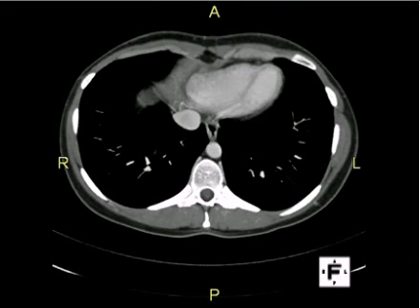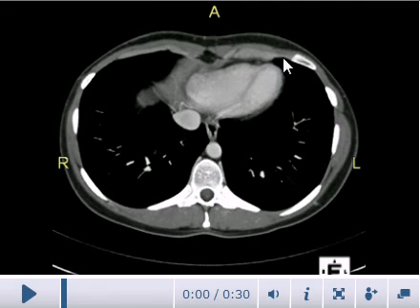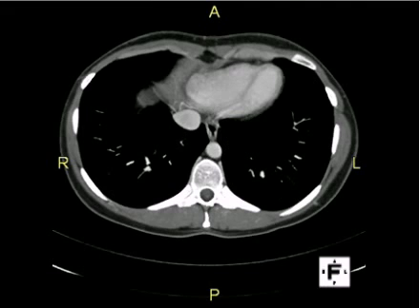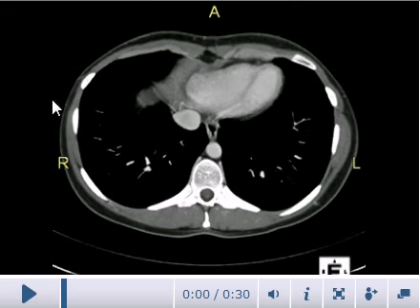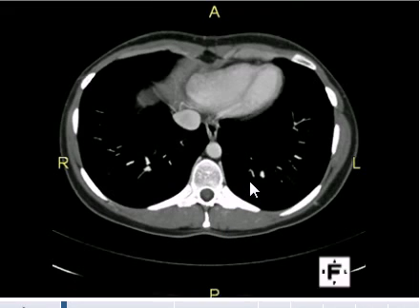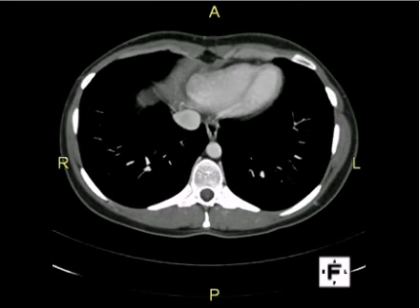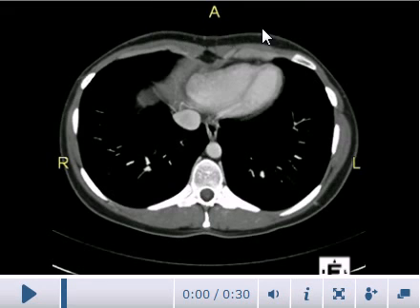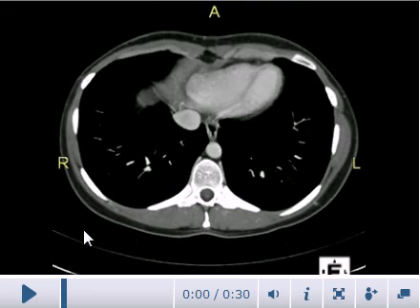The first slice is at the level of the xiphisternum, just above the level of the diaphragm. The black areas are the lungs. This is the right side of the patient and this is the left side. Traditionally, the right side of the patient should be on your left-hand side when looking at an image — whether an X-ray, CT scan, or MRI. This is the anterior aspect and this is the posterior aspect.